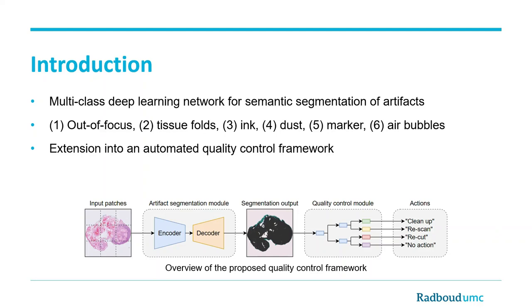In this work we trained a multi-class deep learning network for the semantic segmentation of six commonly seen artifact types. These included out of focus, tissue folds, ink, dust, marker, and air bubbles.